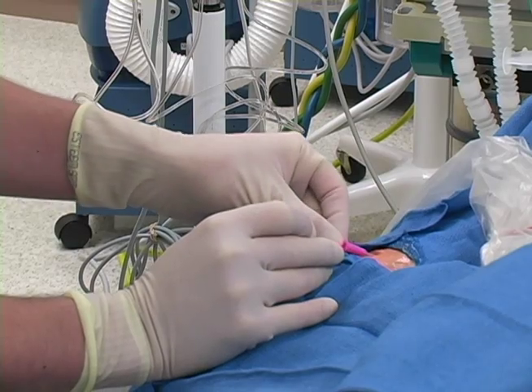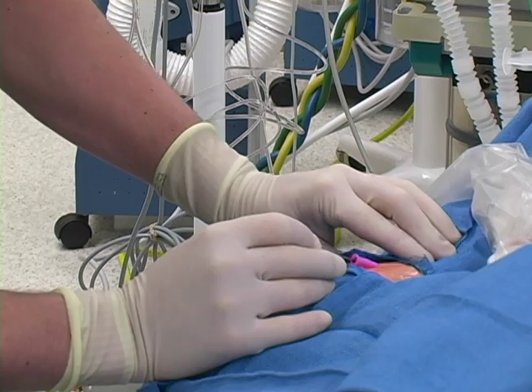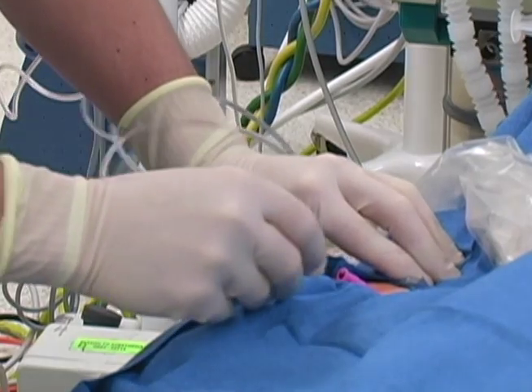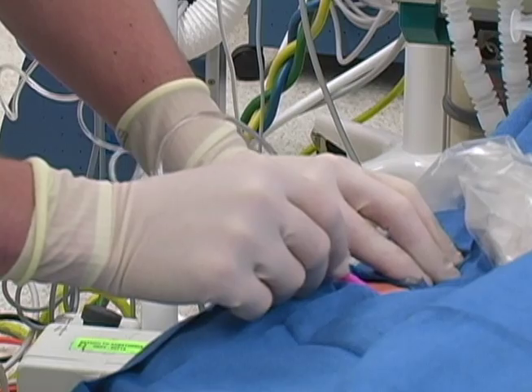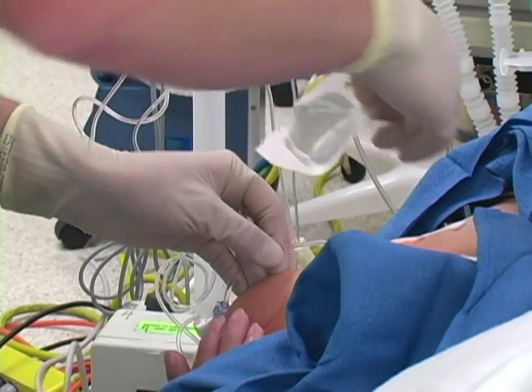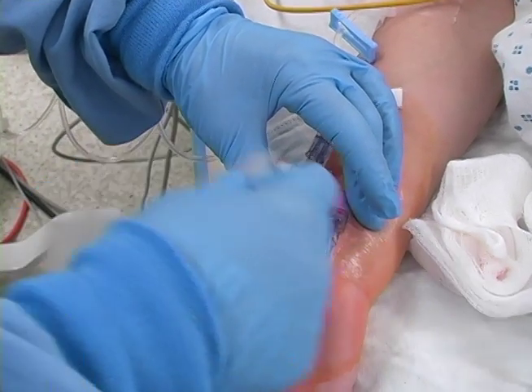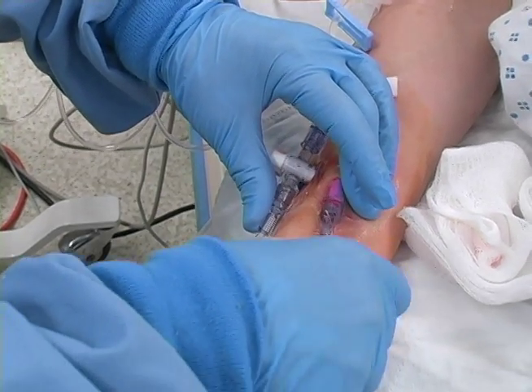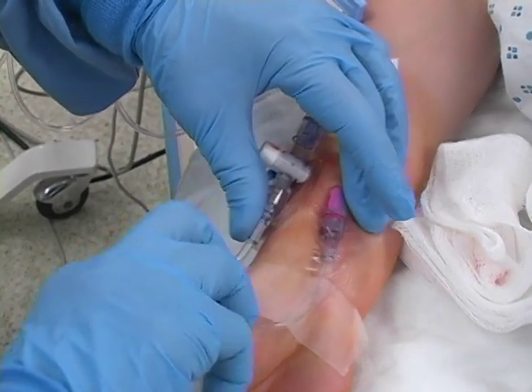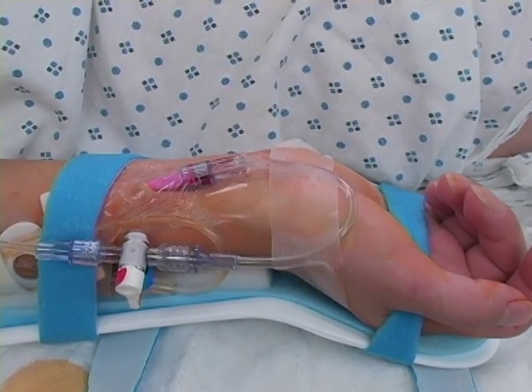The catheter is advanced into the artery and the needle is removed and disposed of. A well-flushed transducer tubing set is attached. Blood and transmission gel are wiped away and a sterile dressing is applied. Additional tape reinforces the dressing and helps prevent catheter dislodgement. An arm board helps stabilize the wrist.